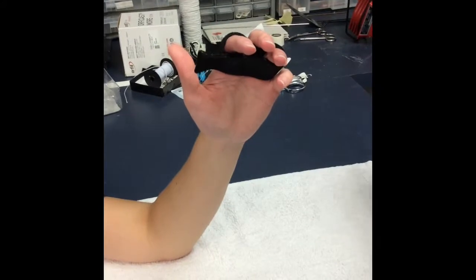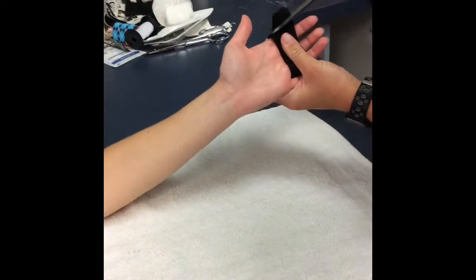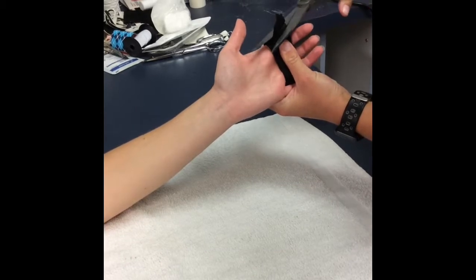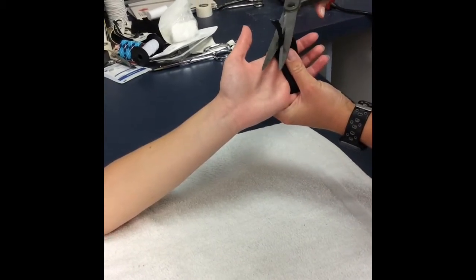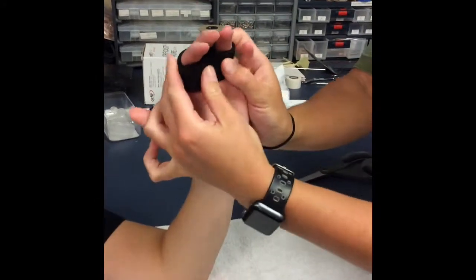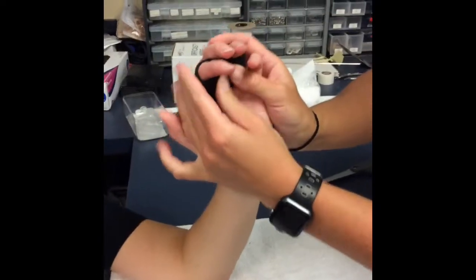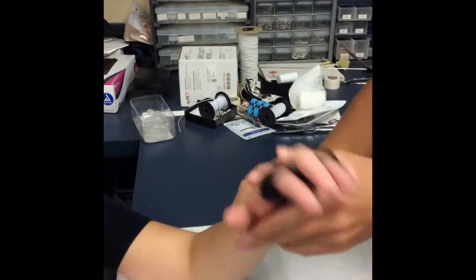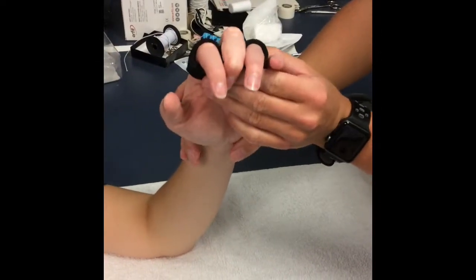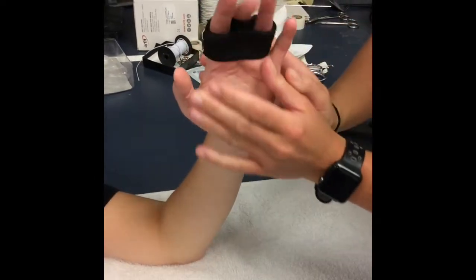Then you can cut the excess material off. Let it cool down and harden. Now she can perform PIP flexion exercises to improve her PIP flexion.